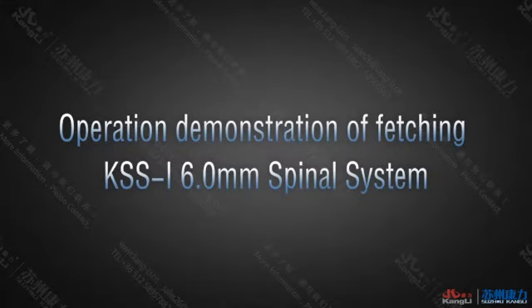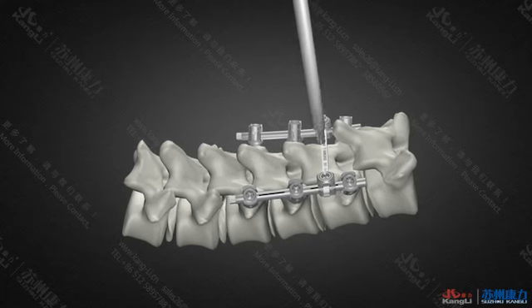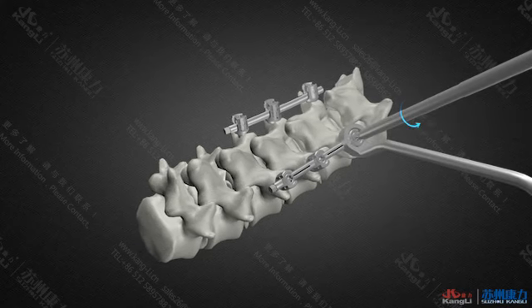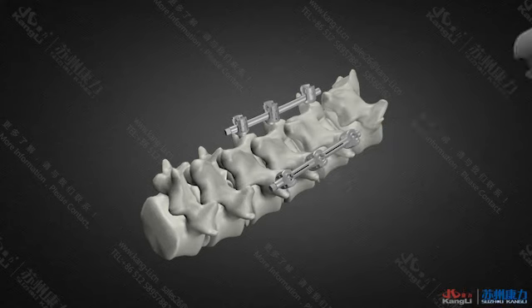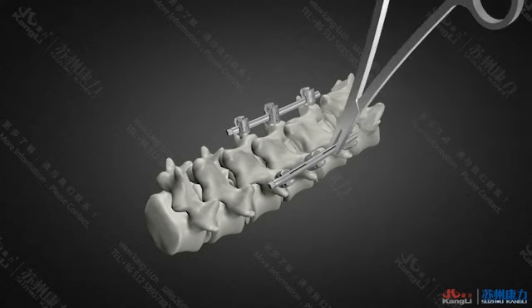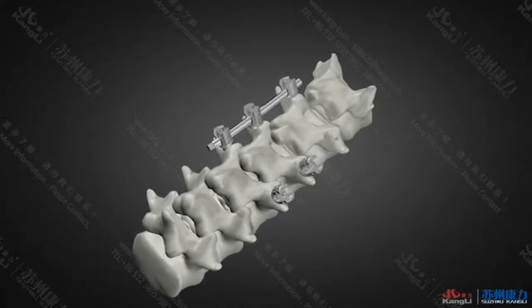Operation demonstration of fetching out the KSS-I 6.0mm spinal system. Use the T5.3 wrench to fetch the EF 6.0 cross links. Then use the T5.3 wrench and anti-rotation device to loosen the plug screw. After that, use the T5.3 plug screw wrench to fetch out the plug screw. Use the rod hold clamp to fetch out the 6.0mm connecting rod. Use the matched nail holder to fetch out the corresponding U-type pedicle screw. Repeat the above to fetch out the other U-type pedicle screws.